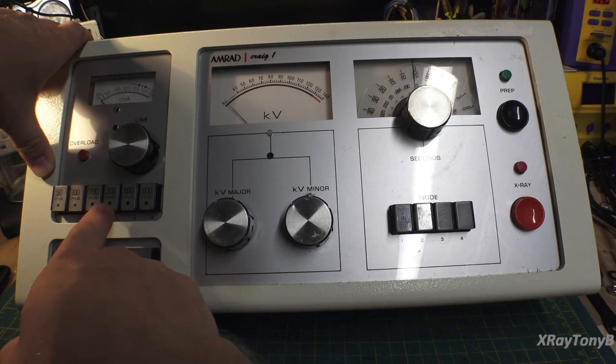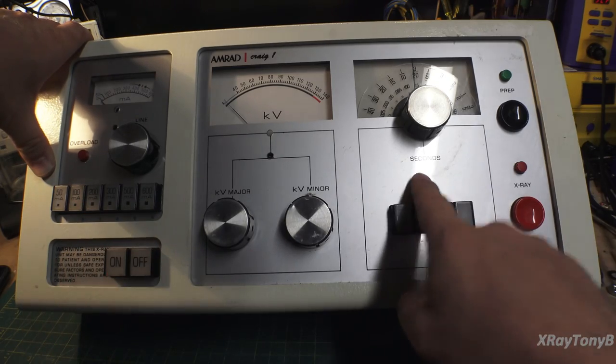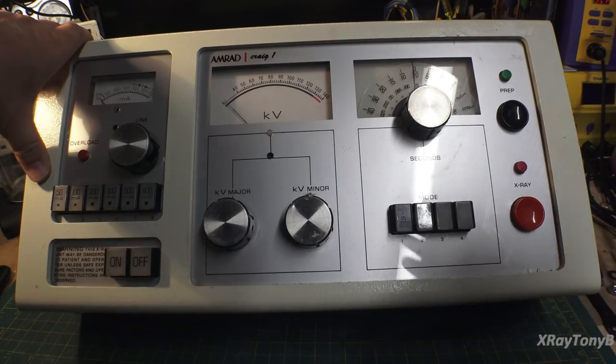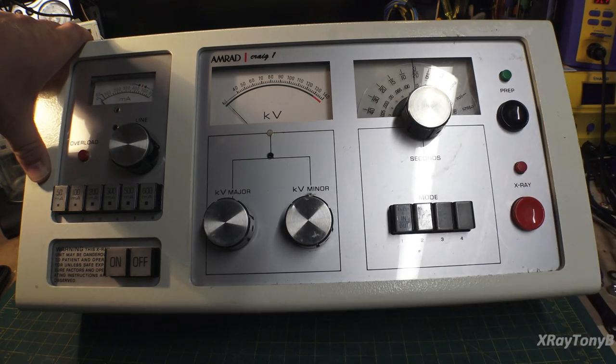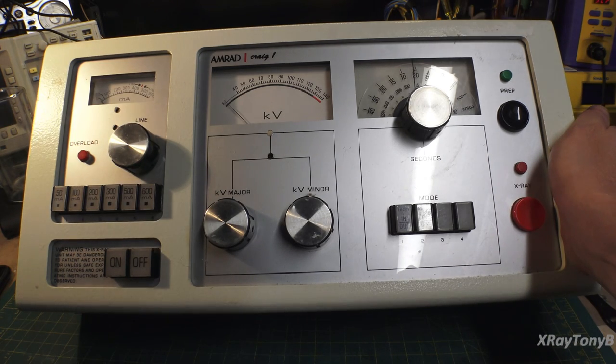So obviously, if we increase our current through the tube, we can decrease the amount of time that the exposure is on. It's very similar to a regular camera that has an iris. You know, the more light you let in, the less time that the shutter has to be open on your camera. So same idea. This is just scratching the surface of how an x-ray machine works.